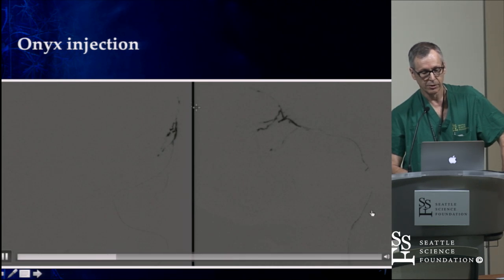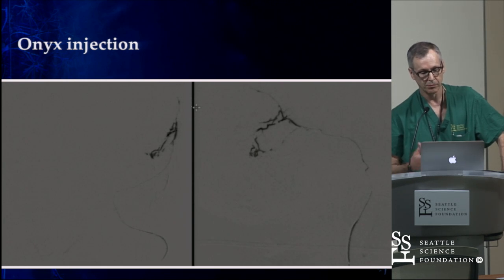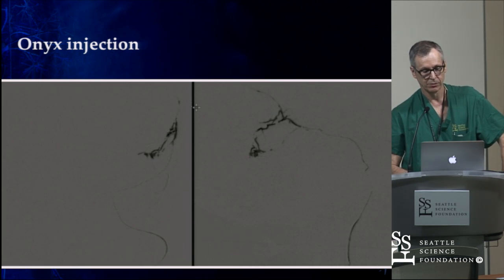And you see that's the catheter. There's no reflux there, but you can just keep going and not have to build a plug. Normally by now you'd be stopping and waiting and building a plug and having patience, which is really boring.